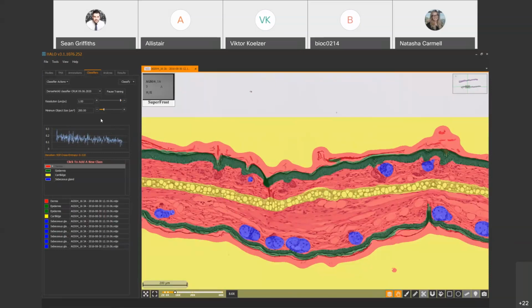Generally with AI, it can detect differences in the morphology of the differentiated tumor compartments. So I guess you've got a couple of options. One is to do your random forest style strategy where you have subclasses of tumor, which would probably work. The other is to try the AI's robustness across multiple tumor types, having a single class, and just see if it's able to group them all. It's only something you're going to find out by testing, but we can also assist you with that testing.